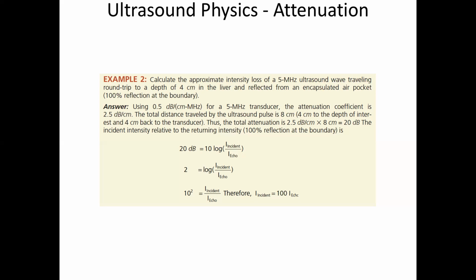So that if you focus down on a small volume, say 1 cc of tissue, and all the ultrasound energy goes on that 1 cc of tissue, using a specially designed ultrasound transducer, you can heat the tissue up to a considerable amount. And this is used for debulking tumors, right? And debulking benign processes a lot, right? So therapeutic ultrasound.